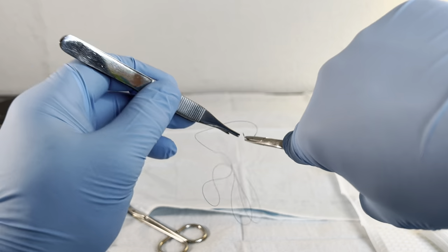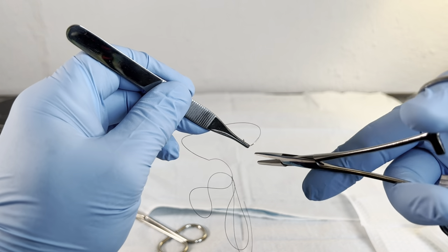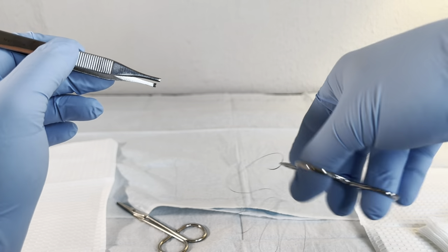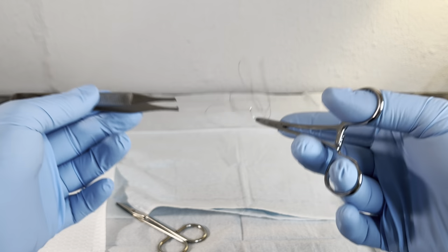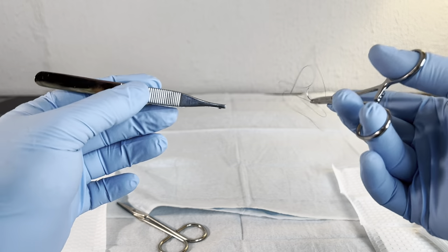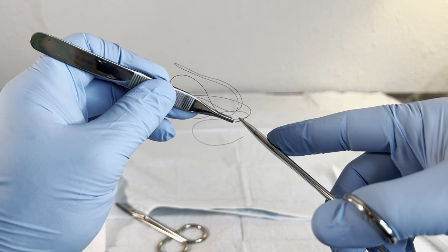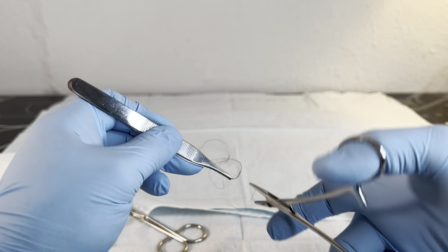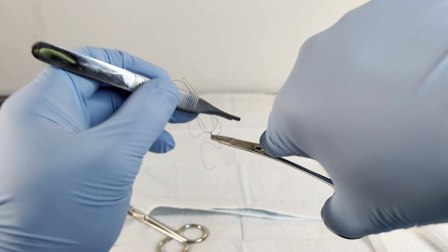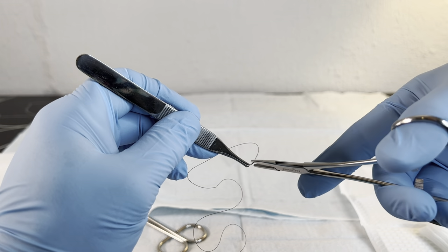Get used to that twist, recollect, reclamp, or reload. Get used to imagining you're going through. And of course, when you have a suture pad — as we will momentarily — you'll see this in action. But even without focusing on the wound, just getting these basic aspects of needle and pickup manipulation into your muscle memory are going to pay off hugely when it comes to the actual practice of suturing in clinic and caring for patients with wounds.